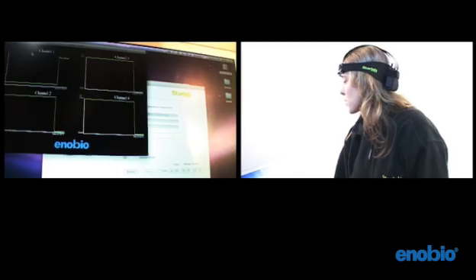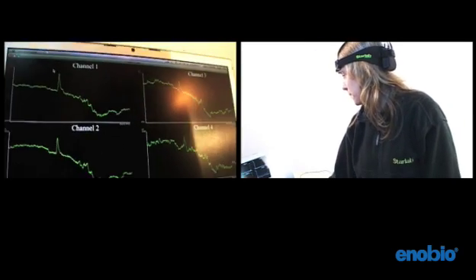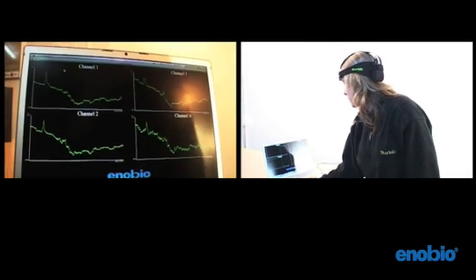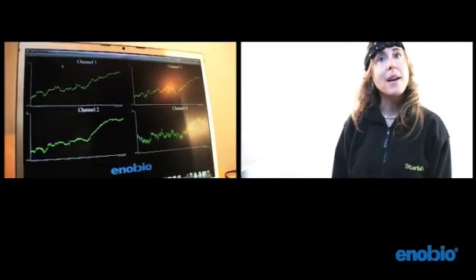When all four of these bars turn green then I know that the calibration is complete and I'm ready to look at my brain signals. Here you can see my brain signals displayed in real time.